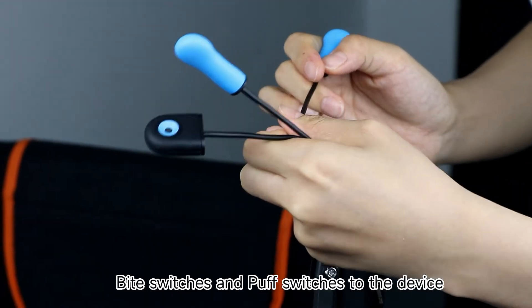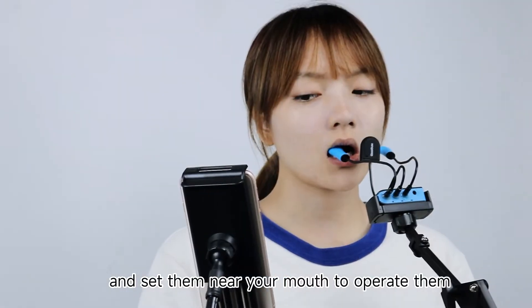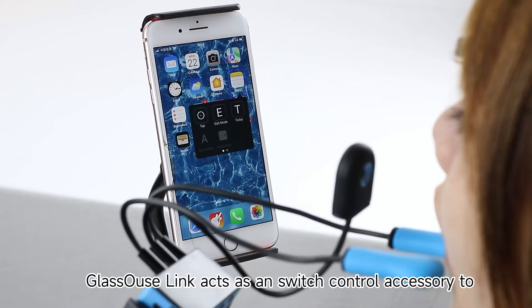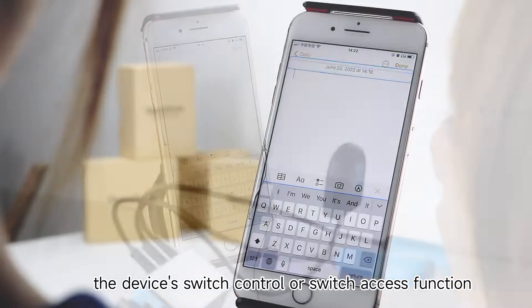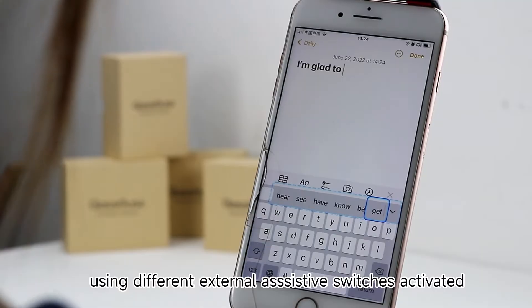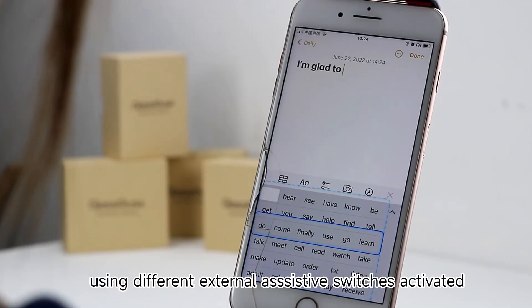The switches are set near your mouth to operate them comfortably without need to move any part of the body. GlassOuse Link acts as a switch control accessory to the device's switch control or switch access function, which enables users to control the device using different external assistive switches activated by the user.